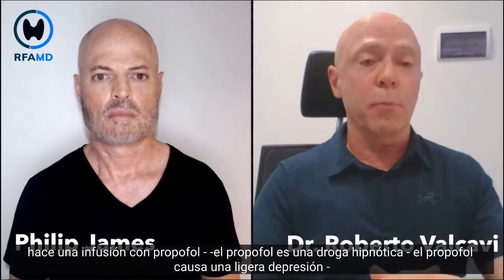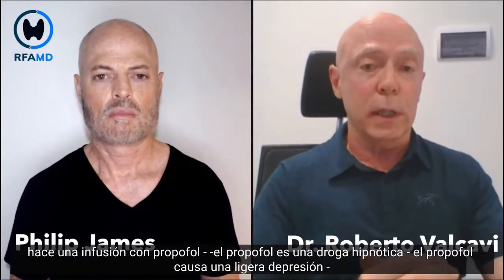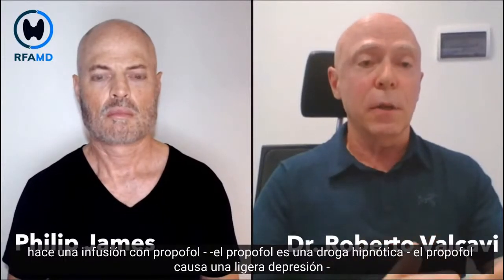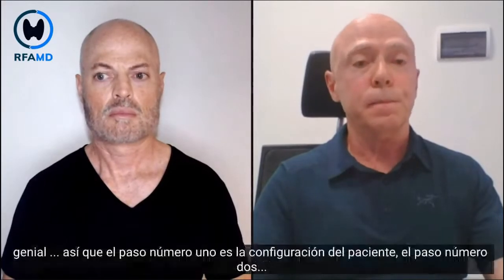After that, he does an infusion with propofol, a hypnotic drug. Propofol causes a slight breathing depression, so we give oxygen in order to maintain normal oxygen saturation in the blood. We monitor, of course, all vital parameters, including oxygen in the blood.